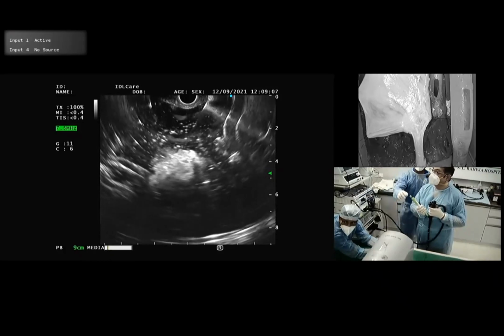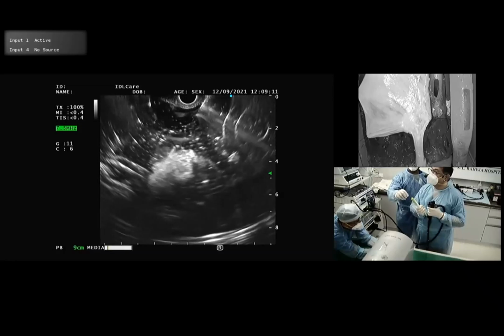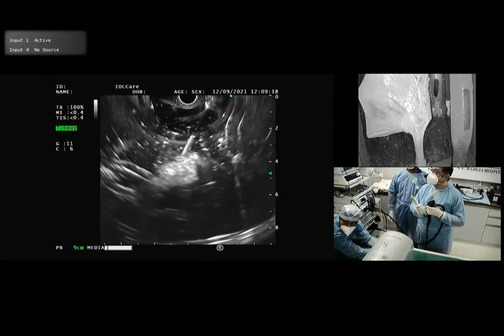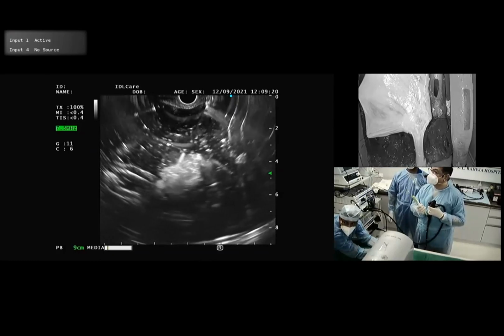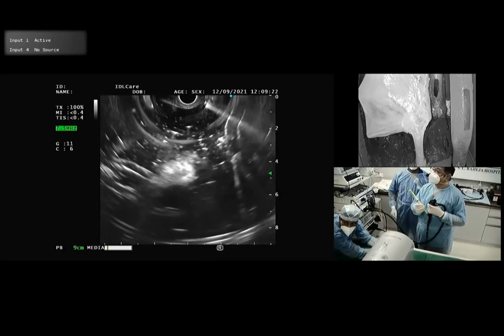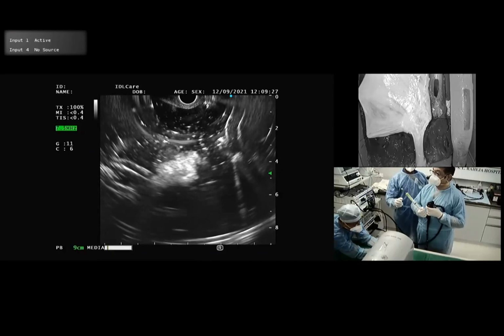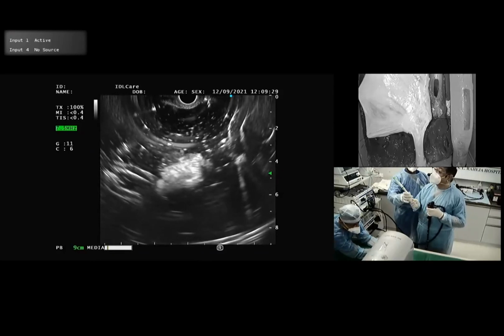Then I can teach you fanning on this. You can fan, see this, using the up-down control. So this is how I teach biopsy to my students. Very simple, very easy. So when you come sometime to our department, we can show you how it is.